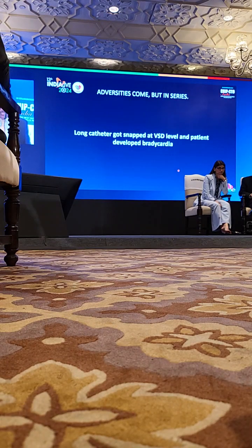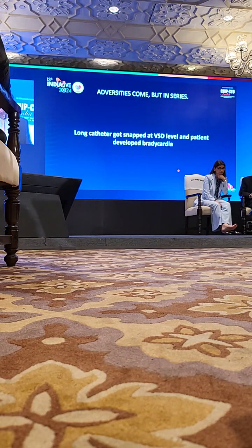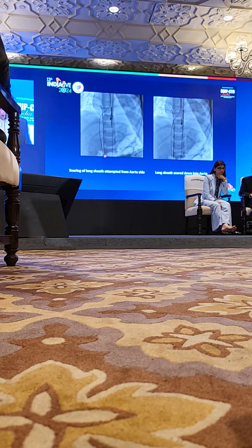So adversities come but in series. The long catheter got snapped at the VSD level, and the patient developed bradycardia and complete heart block. So I had very few options left. I exchanged the 5 French sheath to a 7 French sheath on the femoral artery side, and I snared this end of the catheter that was the other end of the long sheath.